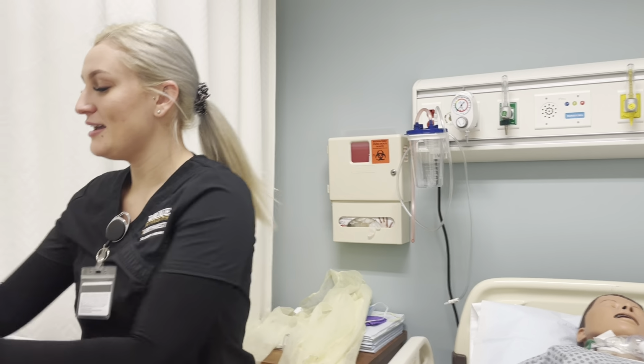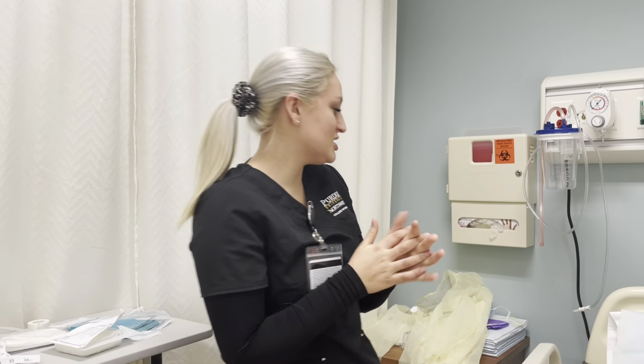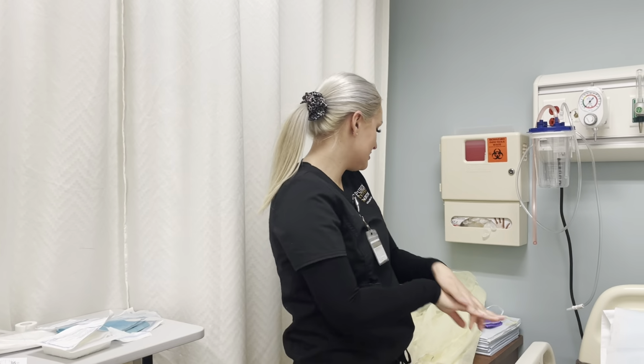Yeah, that's fine. Okay. I'm going to start by performing hand hygiene and then putting on my PPE, starting with my gown. And now I'm going to take my Q-tip and apply it with the medication. Apply it around the incision. Does this have to drop or can I take it out? You can take it out. Okay, and then I'm going to put on my mask.